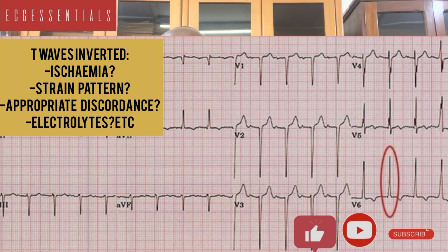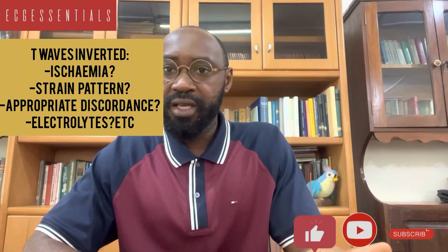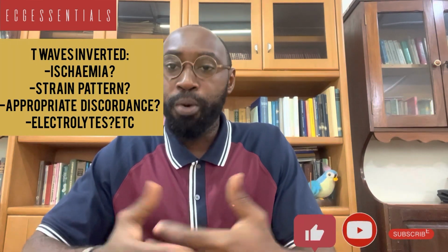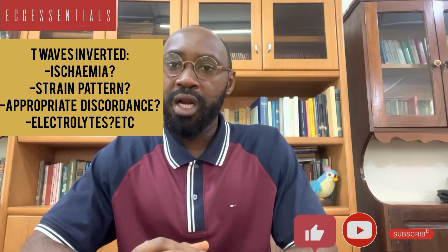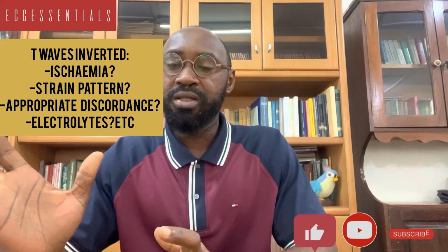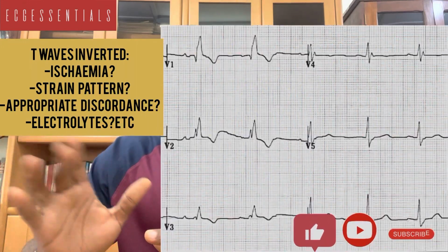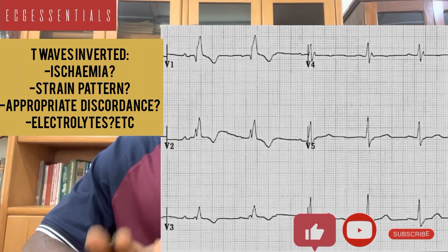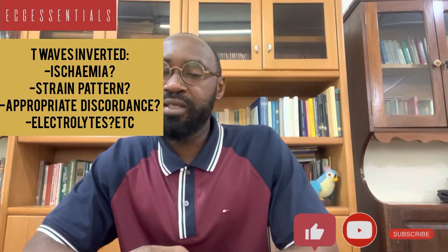All right. When T waves are inverted, the other possibility is that it may be just an appropriate discordance. That may be the case when we are talking about bundle branch blocks and a few other conditions. So it is not always that T wave inversions will mean that there is an ischemia.